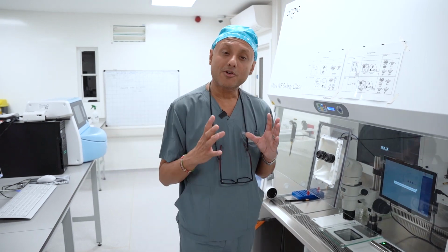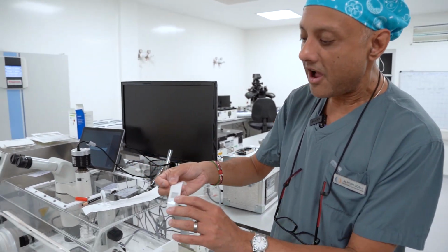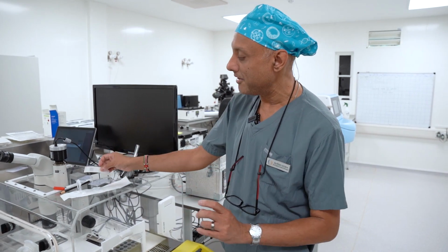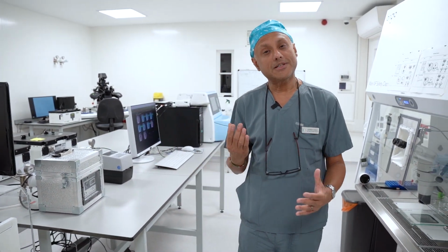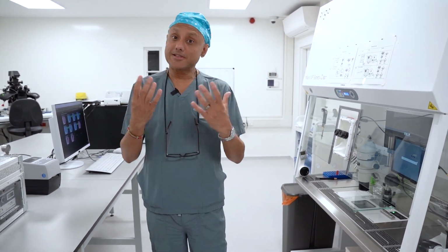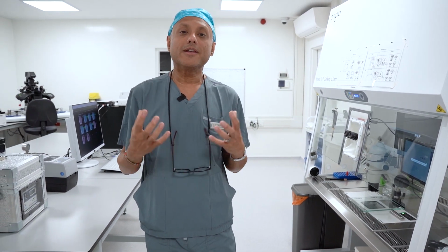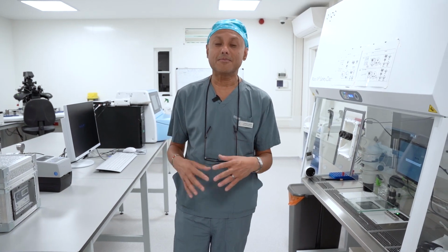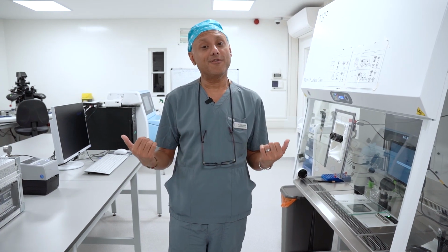We use a procedure called electronic witnessing, and we use certain tags called RFID tags which go on dishes of your eggs and embryos and even your sperm tubes. So every time a sperm sample is produced or an embryo dish has got eggs and embryos in it, they will be tagged with the RFID tag. It's called electronic witnessing, and we are very privileged to have this electronic witnessing system in our lab, right from the front end of the clinic to the back end of the clinic, which processes your eggs and embryos.